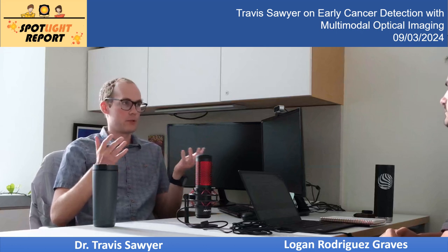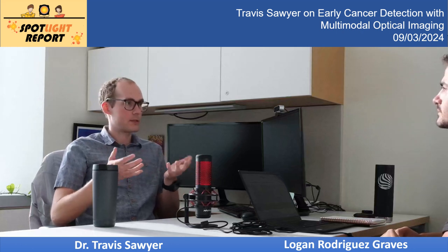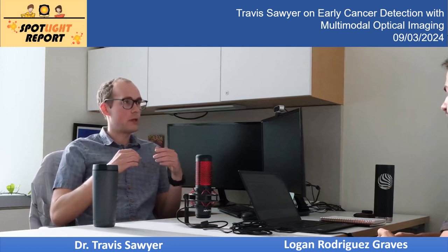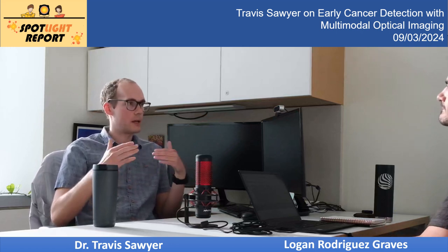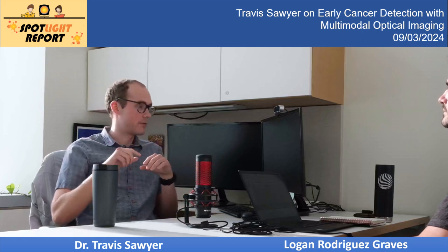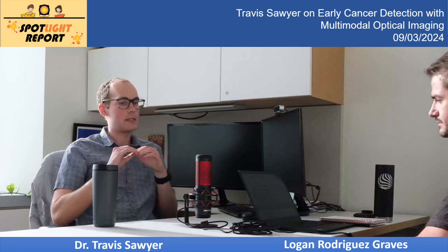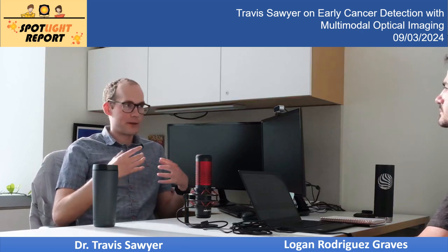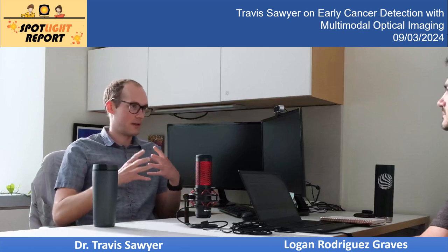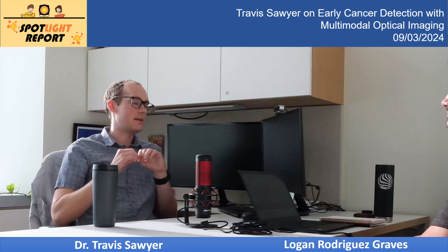This occurs in any type of imaging. So with X-ray, what produces the contrast is absorption. For optical wavelengths, you can have different types of contrast mechanisms. We might talk about OCT shortly. That's all about microstructure. Anytime you have different refractive indices, you'll have some back reflection of the light, which lets you form a nice 3D depth profile using OCT. Cancer really disrupts the microstructure. You might have nice ordered tissue, and then you have a giant tumor growing, and that's going to totally mess everything up. So it appears really nicely on OCT.